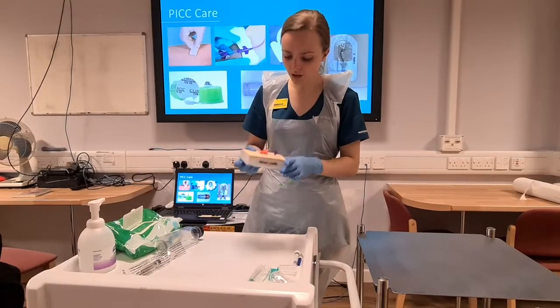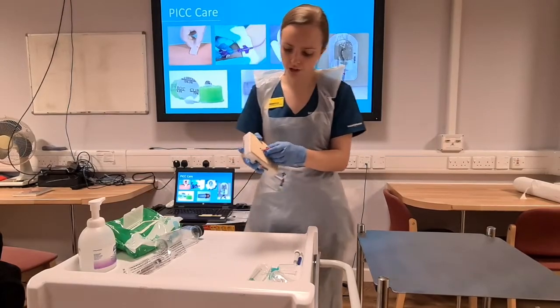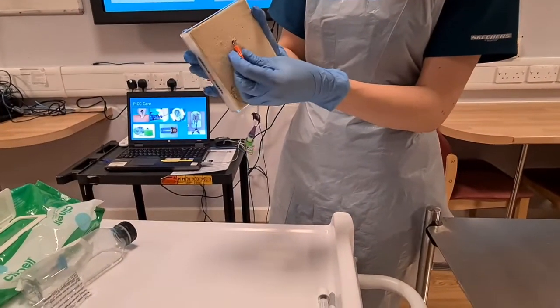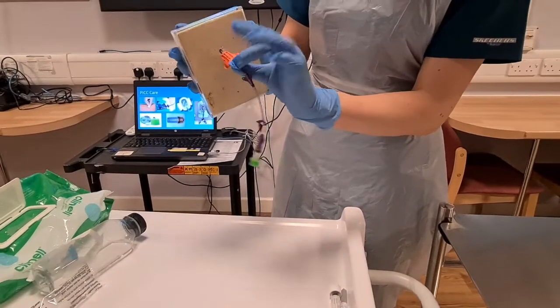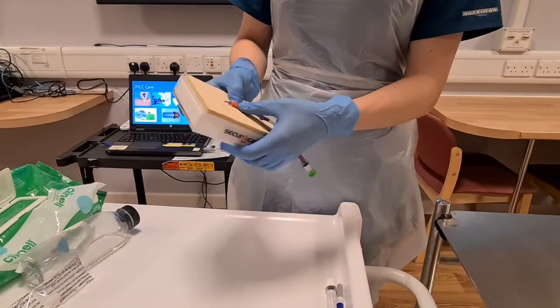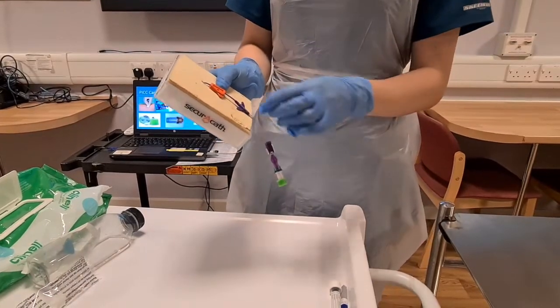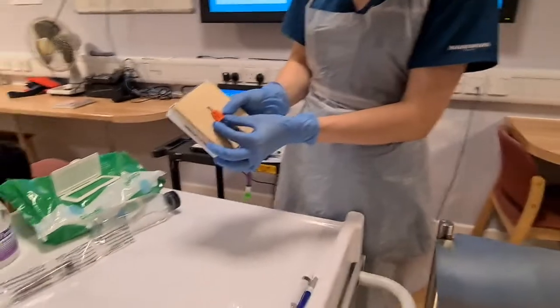Right, so I'll quickly go through a Securicath with you. I've already shown you what is underneath the Securicath. That's tucked underneath the patient's skin, so it's going to be quite difficult for the patient to pull it out. That's why it's in. The Securicath stays in as long as the PICC line stays in. Once the PICC line is finished with, we're done with all the IVs and the patient's no longer on IVs, we can then remove the line.